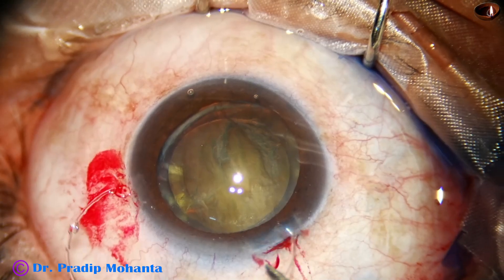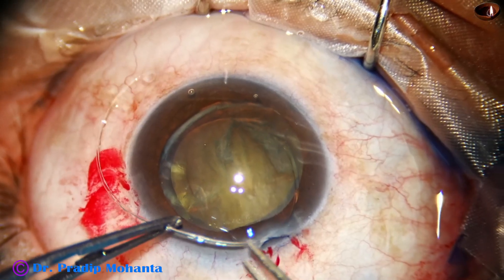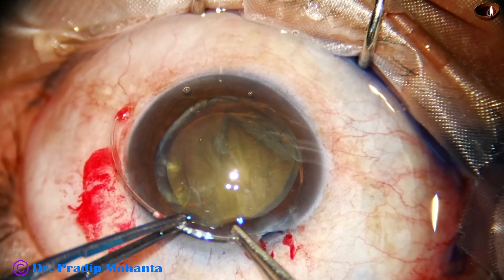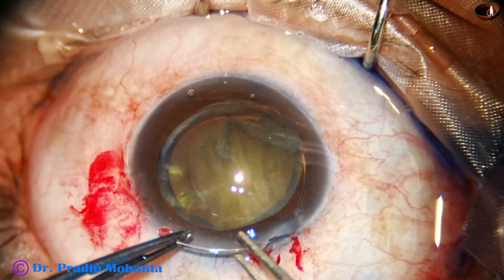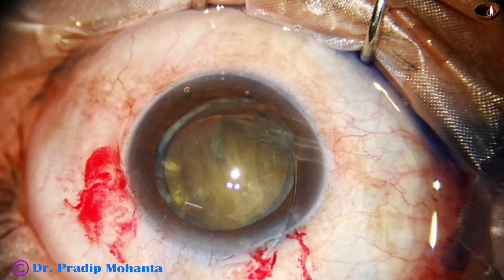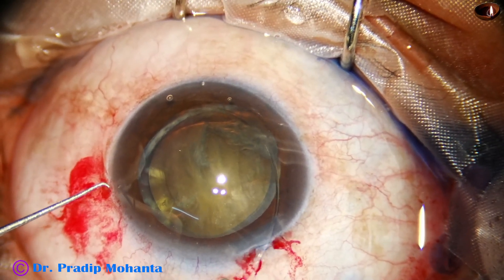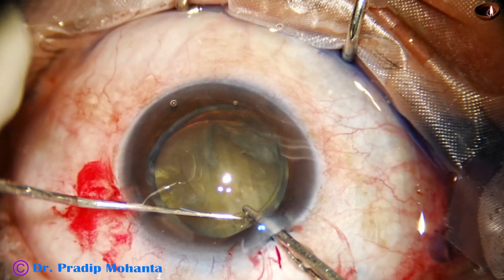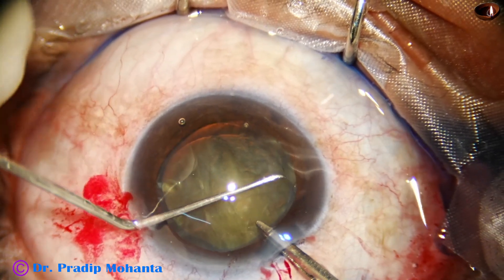Hydrodissection is done and a CTR is placed in the capsular bag. The leading end goes into the capsular bag and is gently pushed in. As we come near the trailing end, I take a Sinski hook in my left hand. The trailing end is placed in the anterior chamber with the McPherson's forceps and the Sinski hook places the trailing end into the capsular bag.